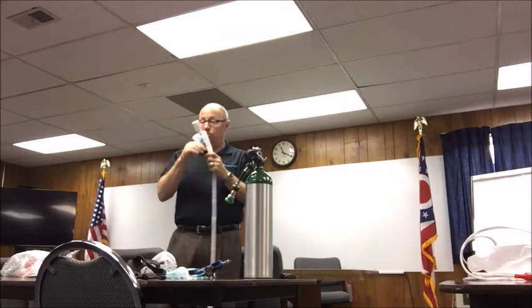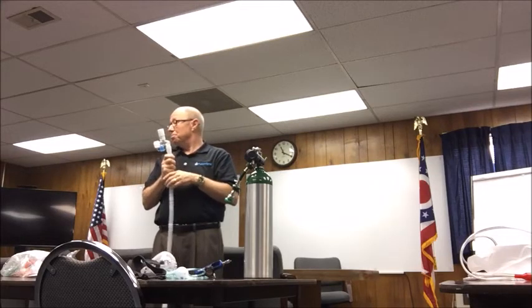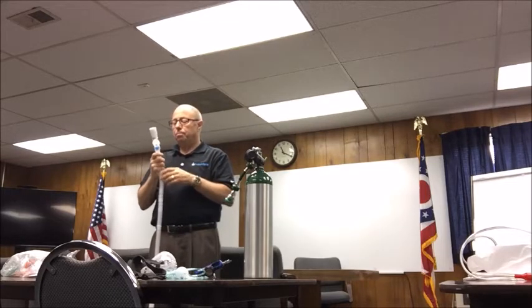The service that I used to work for, we start at 10. There's a lot of doctors that feel that, just hit them with 10. That's fine. They're the doctors and I'm not. But so work your way up.